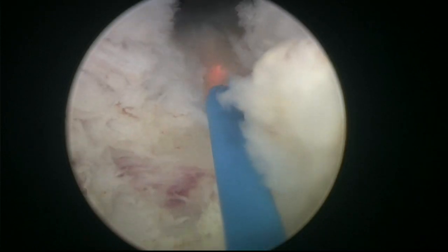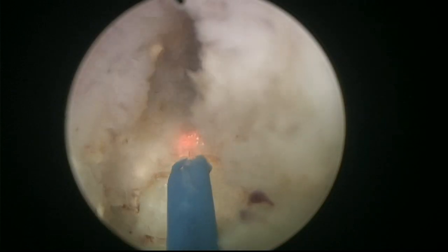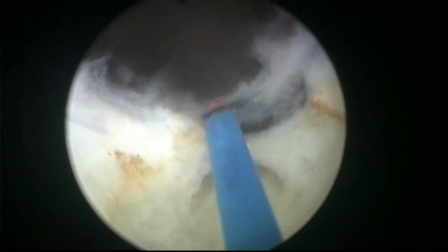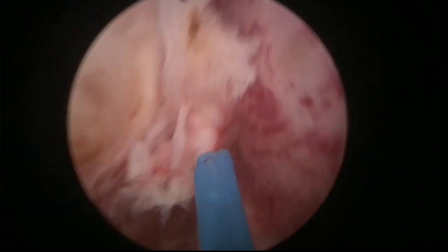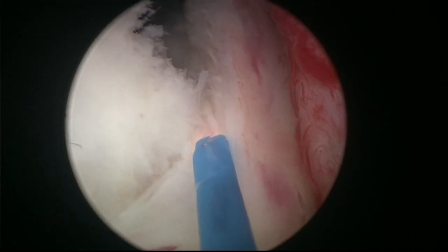Let's go in and see where the ureteral orifice is — it's there, more or less. So we are only going to do about half of the incision. The depth is going to be reaching the bladder neck fibers, here you see. When I want to continue with the incision, it is already much shorter. Basically, when you do this incision in two parts — the bladder neck part, then continuing downwards — you are making a simpler incision, especially when you are starting.